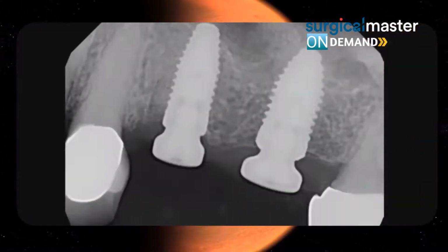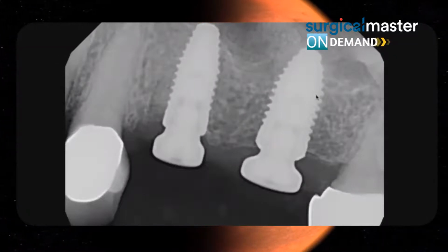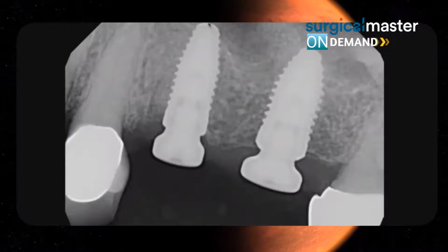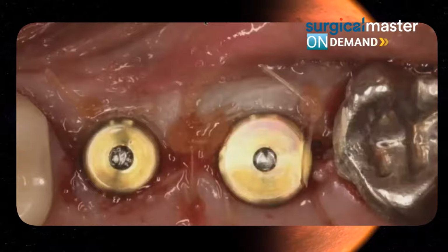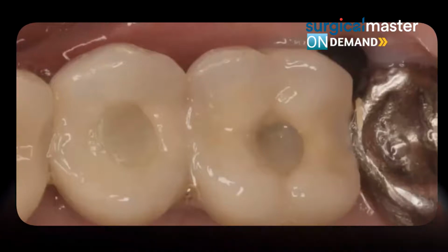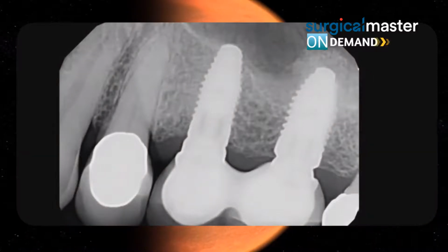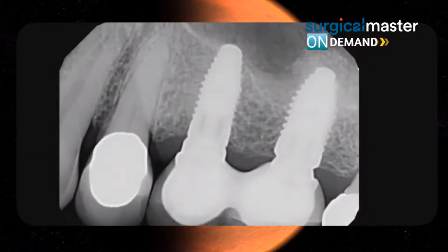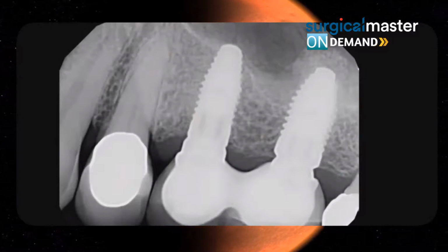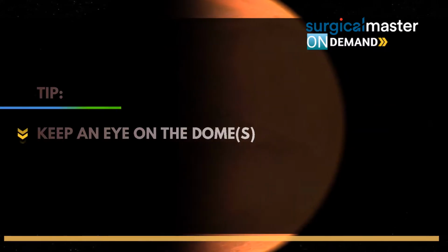Here it is right after the placement. You see my molar is mostly in native bone, or maybe 50% in native bone. The premolar has a little bit of sinus lifting. The tip of the implant is anchoring the floor. Here's my flap sutured around the healing abutments. And here's the restoration with obviously screw retained access to the restoration, and about 6 years follow-up on this case. Great implant opportunity, a picture that says 1,000 words. Without the sinus lifting, this case would not have been possible. This is the implant opportunity we're talking about.